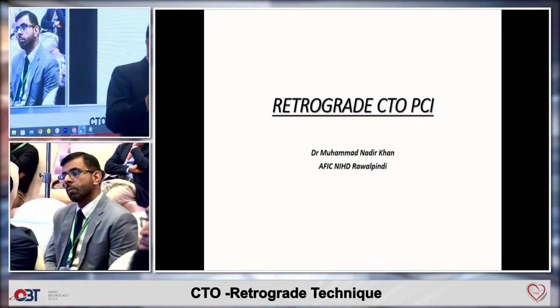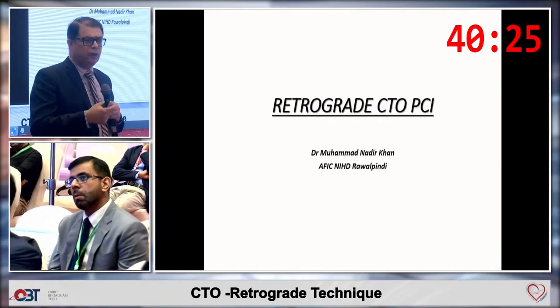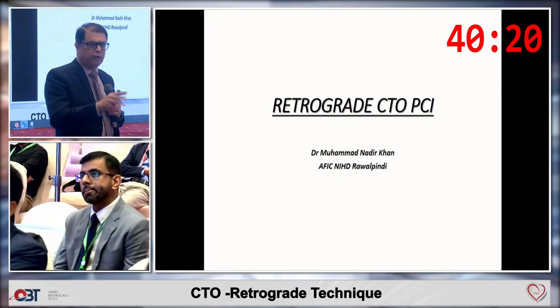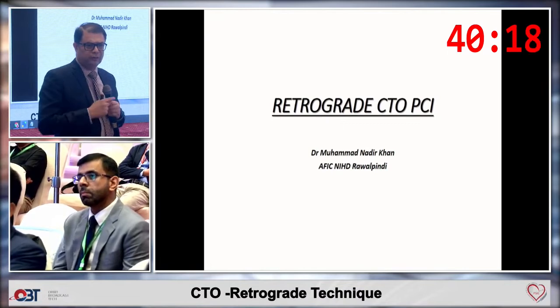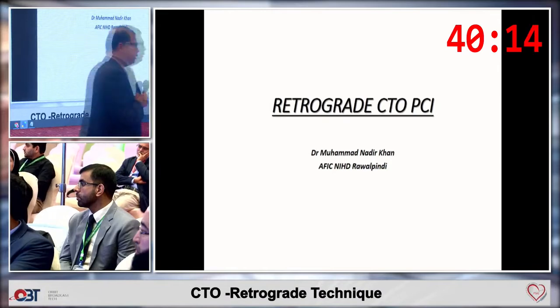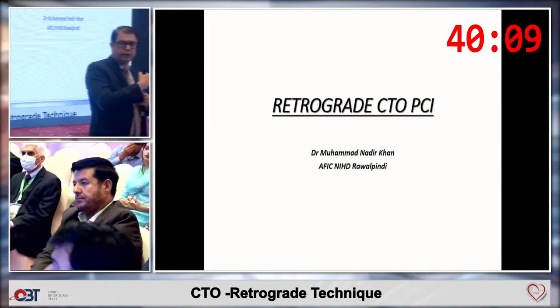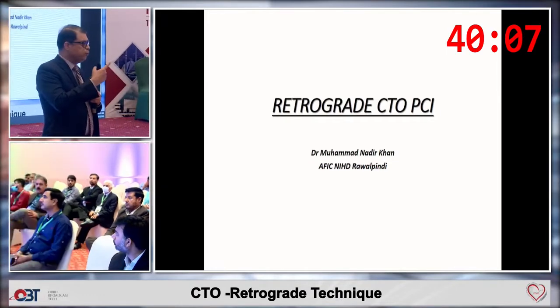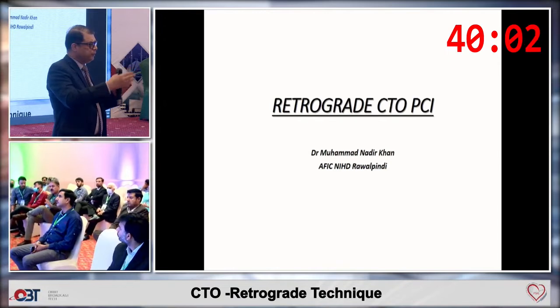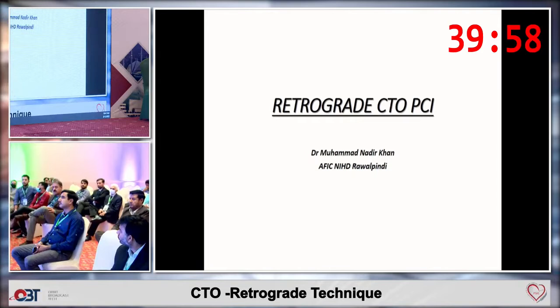Some people cut a balloon and then push it distally in a distal perforation. But I believe the most reliable method is putting in a coil, because then you are sure that this will occlude. Yes, this is mainly for distal wire tip. But coils can be used for these collateral perforations because they can be very difficult to treat. So you have to coil them from both sides, because the collaterals are coming from this way and that way. If you don't coil them from both sides, they'll still keep bleeding.